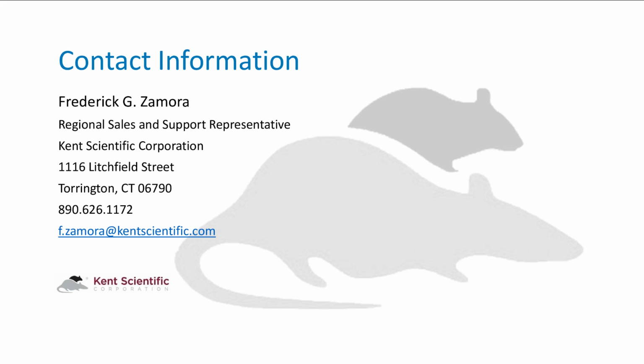So in terms of a multiple animal setup, you'll need to adjust it as necessary toward your particular lab. So if you have it set, for maintenance, at 200 mils per minute at, say, 2%, you could keep that setting for all three of your animals.